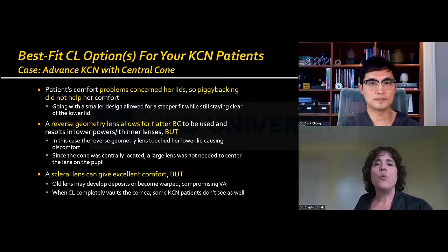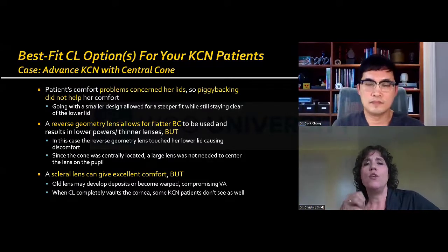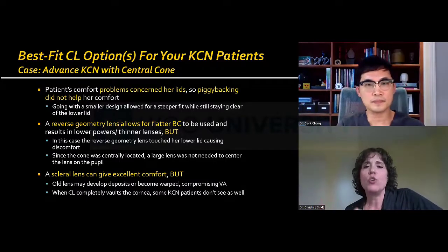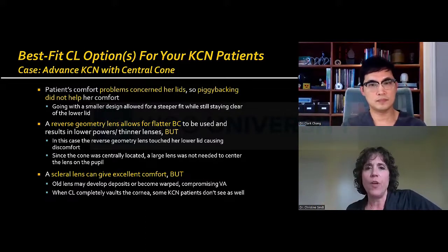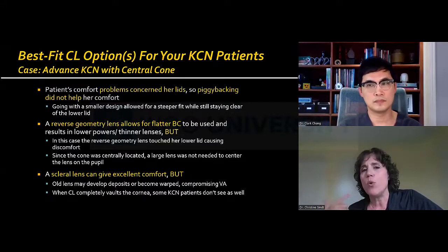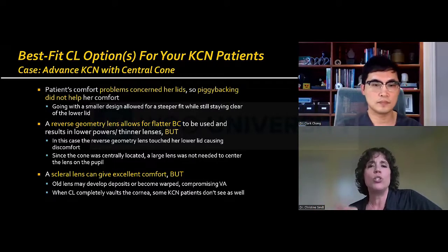Okay. So when you think about these advanced cones, this nice central cone, in her particular case, piggybacking had not helped her because her problem was her eyelids, not the cornea itself. So if you piggyback somebody and they still are uncomfortable, I want you to think, what do I have going on with the eyelids in this case? And am I touching or hitting the eyelids? Is the lens moving too much? And you may want to consider altering your design to alter that lid interaction.